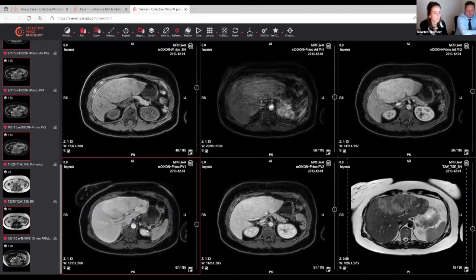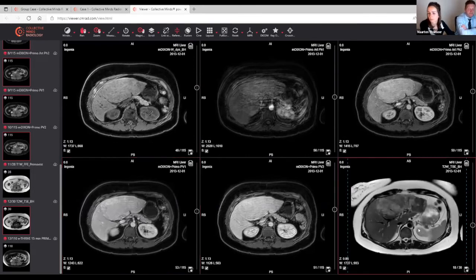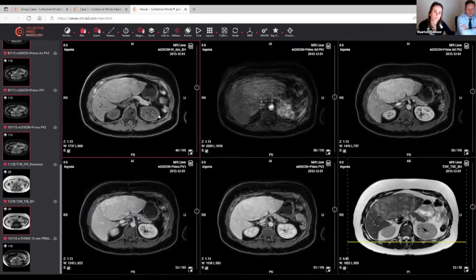Well, I don't think that a biopsy is necessary. You won't do a biopsy? Or maybe, because it's a big lesion. If you have a lesion larger than 5 centimeters, the suspicion of malignant degeneration is higher. So we always do a biopsy of a lesion larger than 5 centimeters, or if there are worrisome signs. But here, this is a typical adenoma, there's no washout, no other worrisome signs, but it's too large. So I would advise in this case to do a biopsy.